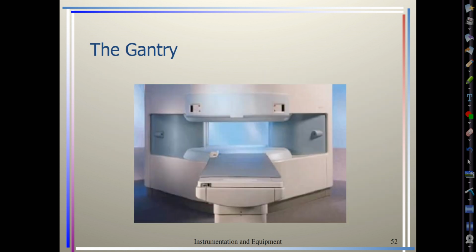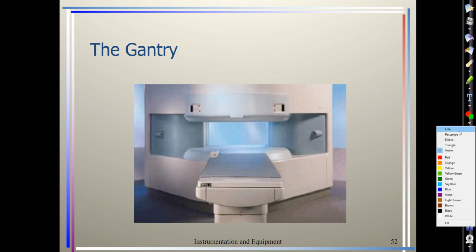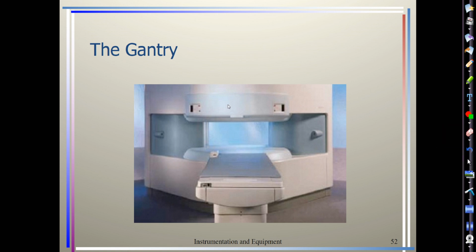What kind of magnet do we have here? Open. How is our flux line? Is it vertical or horizontal? It's a vertical flux line. Yep. Any of these open systems, our flux lines are going to be vertical. Stronger Tesla strength than our superconducting, or less Tesla strength? Less. Usually about 0.2 to 0.4 Tesla. But these are great for our claustrophobic patients.